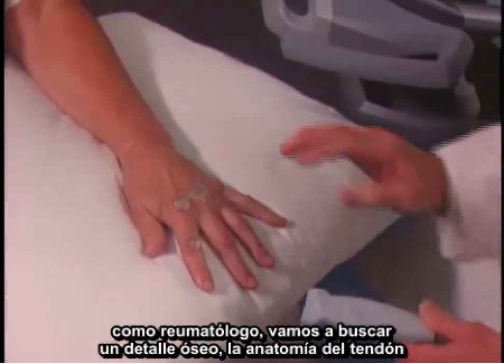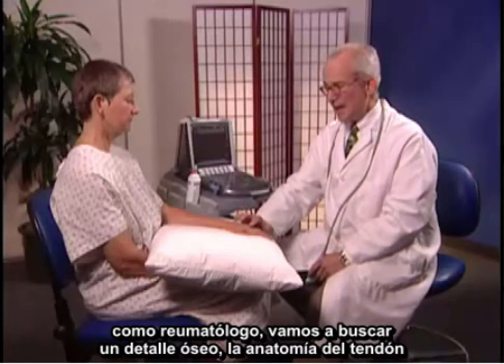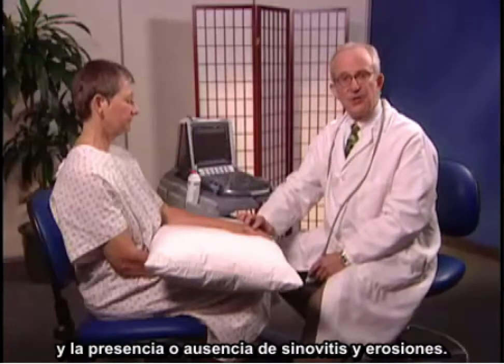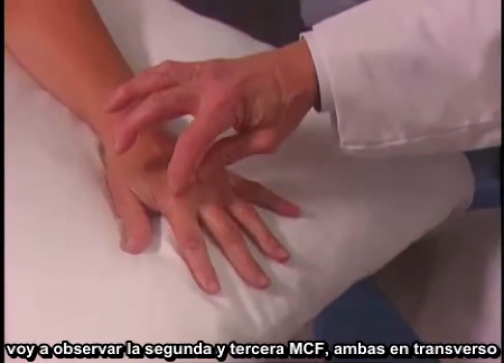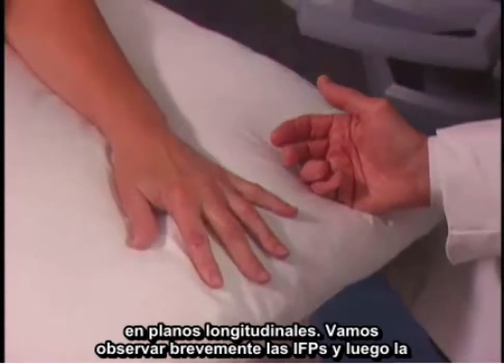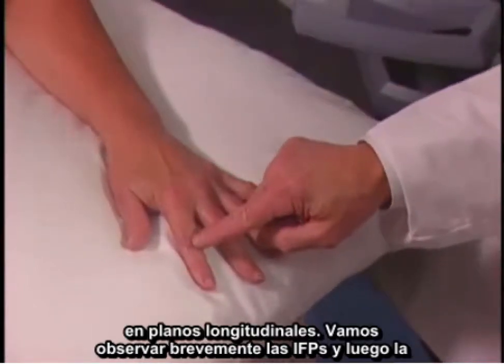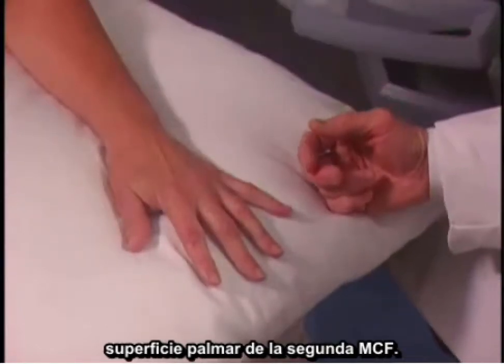As a rheumatologist, we're going to be looking for bony detail, tendon anatomy, and presence or absence of synovitis and erosions. I'll look today at the second and third MCPs, both in the transverse and longitudinal planes, and we'll take a brief look at the PIPs and then the palmar surface of the second MCP.